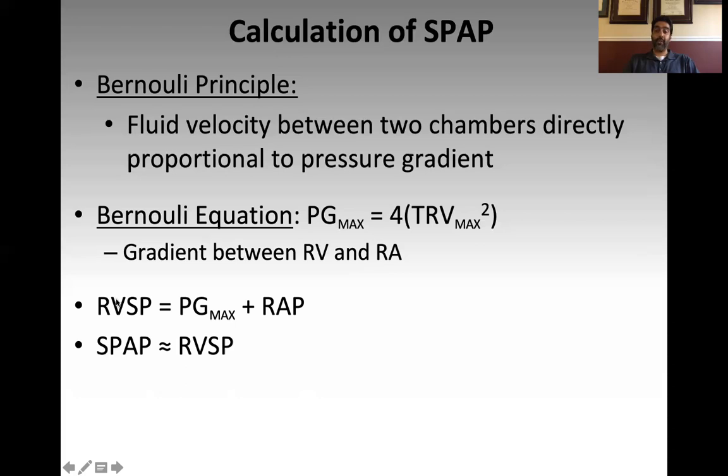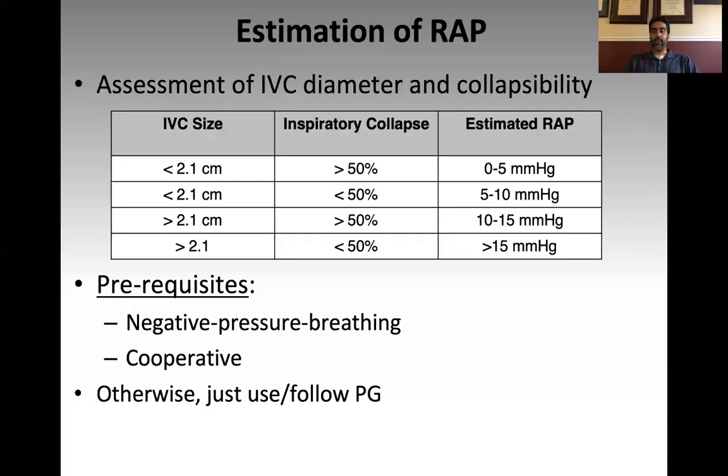Now, how do you calculate right atrial pressure? Non-invasively, that is based on the assessment of IVC diameter and IVC collapsibility. If you have a central line in place and you're at a place that measures CVP, you can use the CVP number as long as the tip of the catheter is at or near the cavo-atrial junction and it's properly zeroed. But we don't do that anymore, so you're less likely to find that. You can use a non-invasive method looking at IVC diameter and IVC collapsibility.